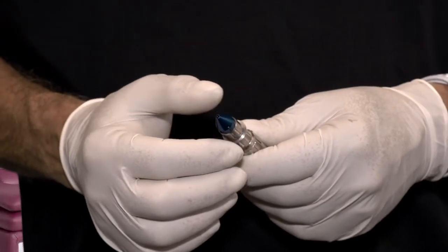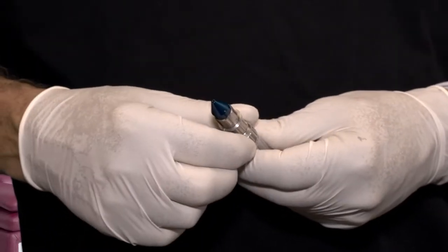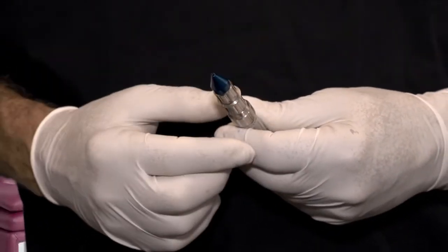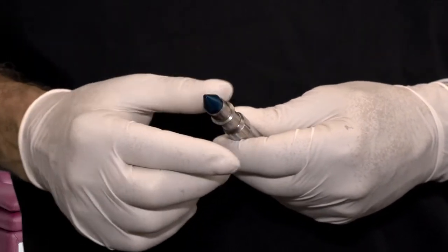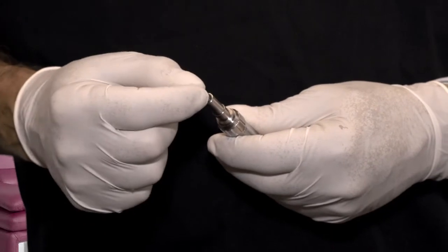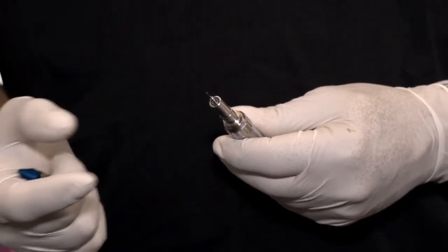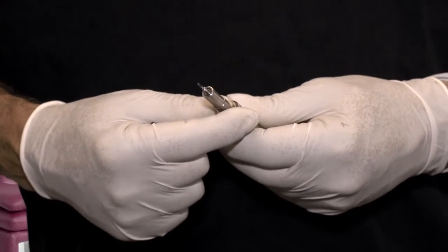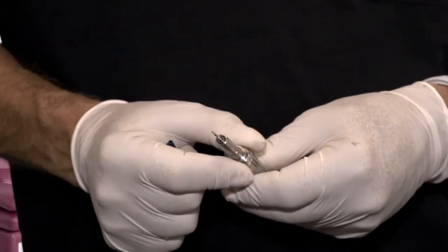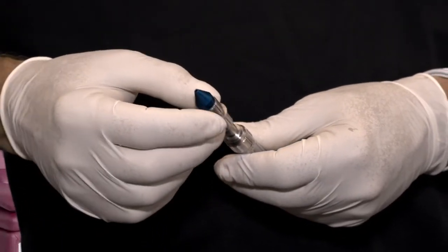To remove the depth stop and the punch, simply rotate the locking nut until you hear the click. Then unscrew the depth control and you can remove the punch. Replace it back in the hole, rotate the locking nut until you hear the click, and then reapply the depth control.